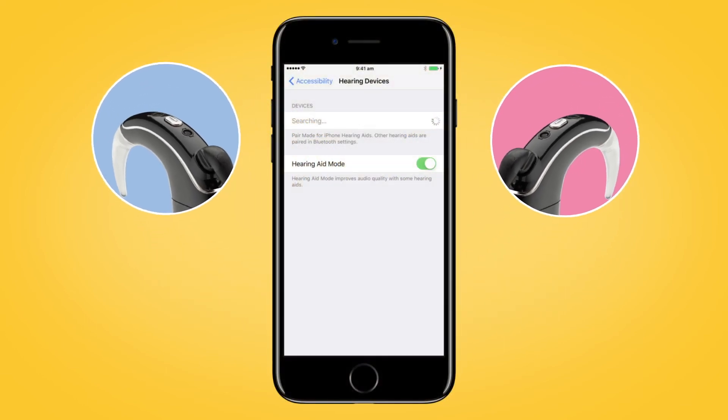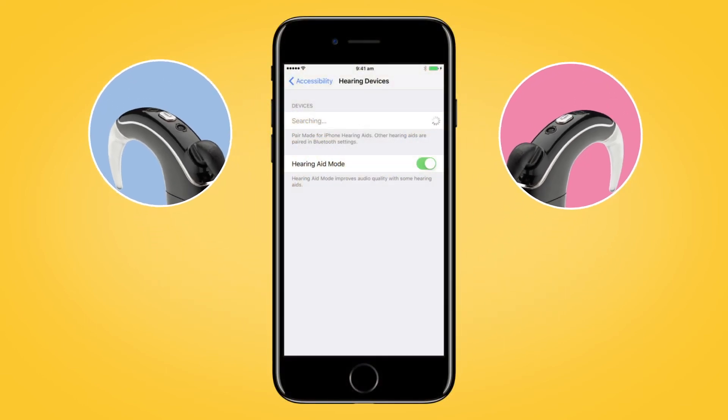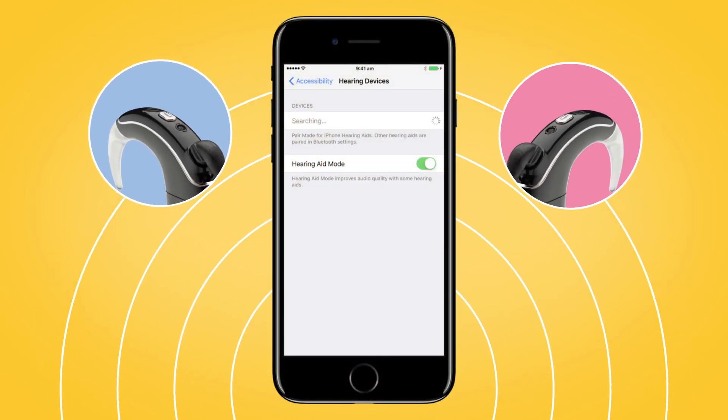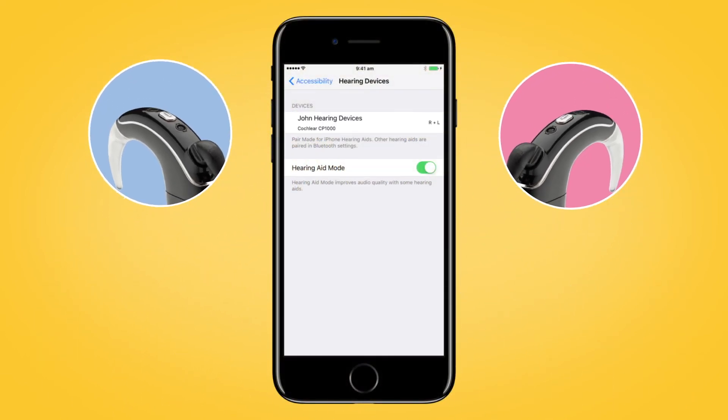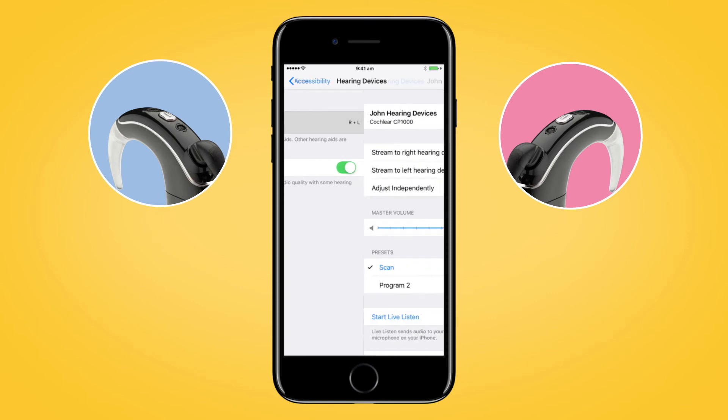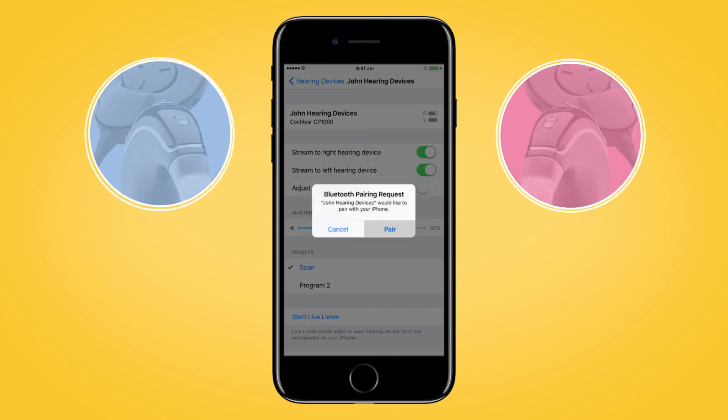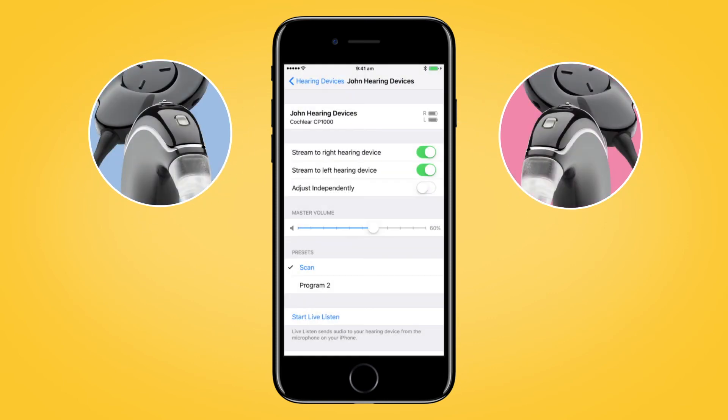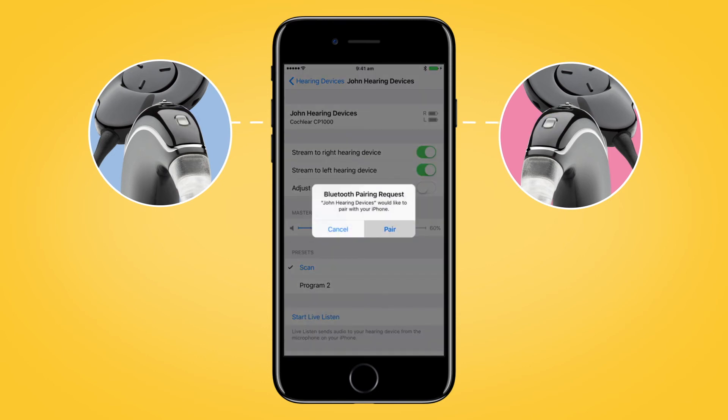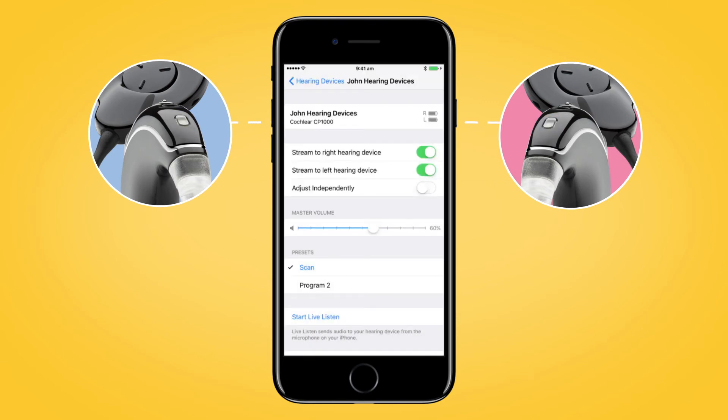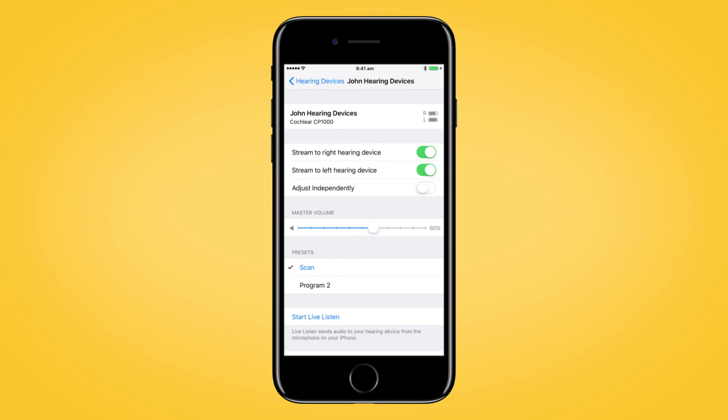Your compatible Apple device will search for your sound processors and display them as a pair here in the Devices section. Select the name of your processor and then tap Pair for each side to begin pairing both your Nucleus 7 sound processors with your compatible Apple device. Make sure to confirm pairing is finished as previously described for each processor.